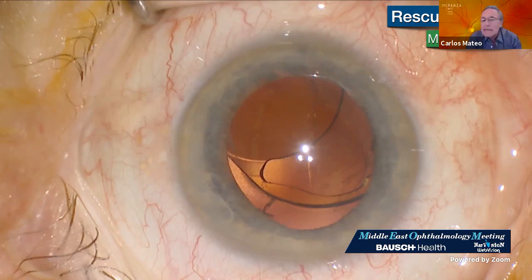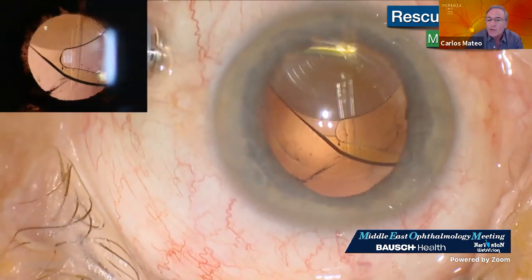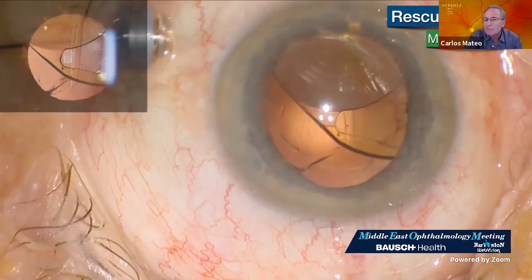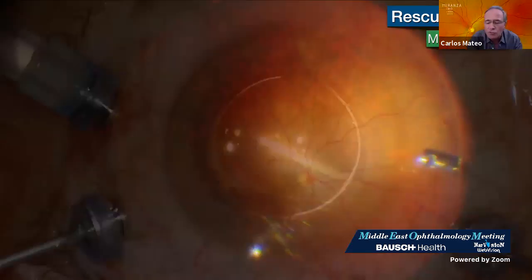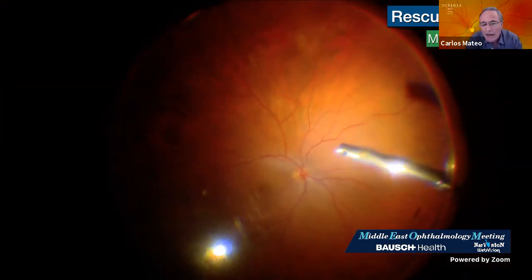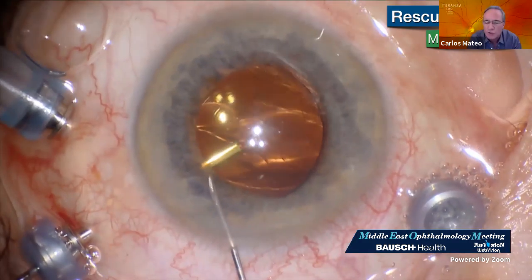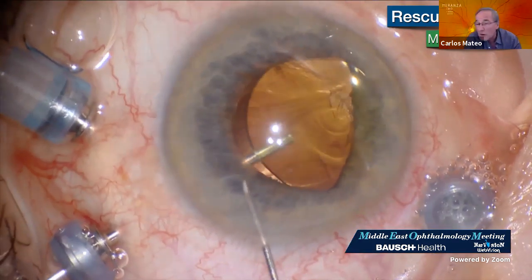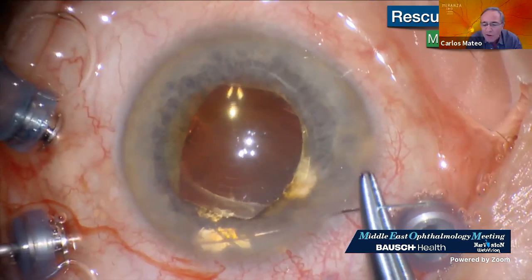And even these lenses, you can suture to the iris when the capsular support is very bad. I decided to suture this lens to the posterior surface of the iris using 2 sutures. The centration is very good. It's very important for these patients with multifocal IOLs.